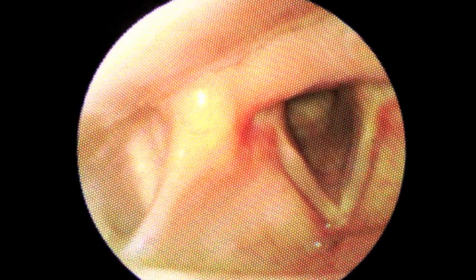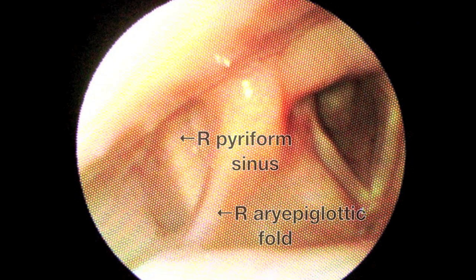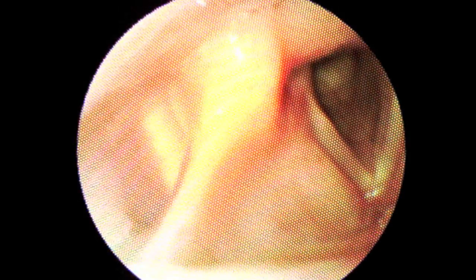By shifting the scope from one side to the other, you can take a closer look at the piriform sinuses and the aryepiglottic folds.